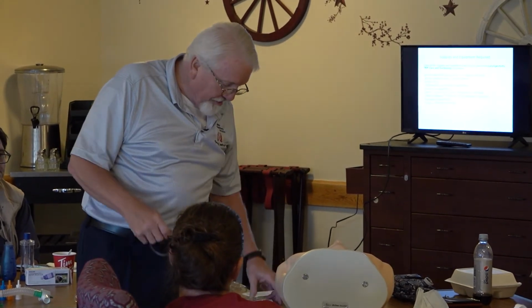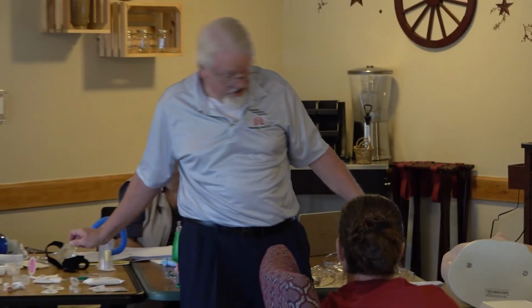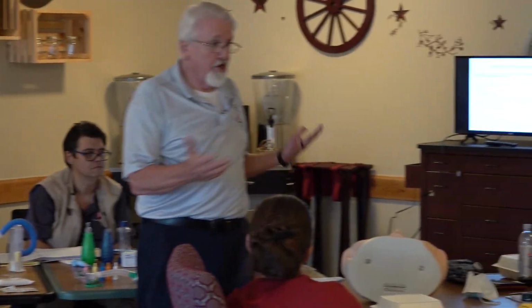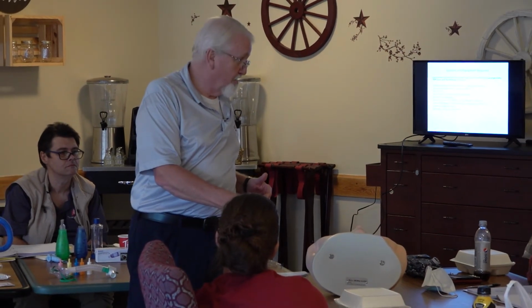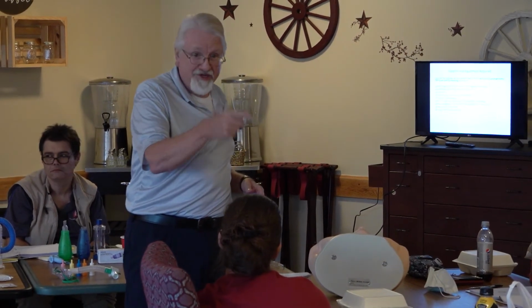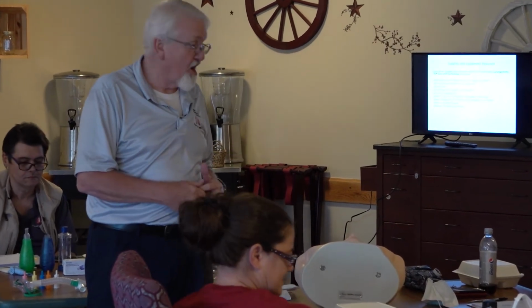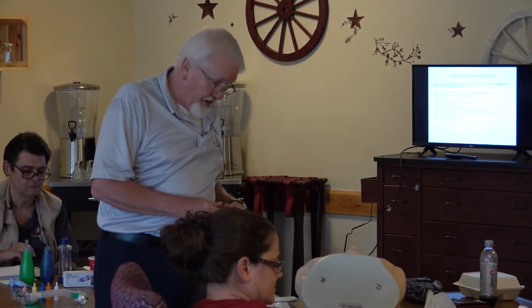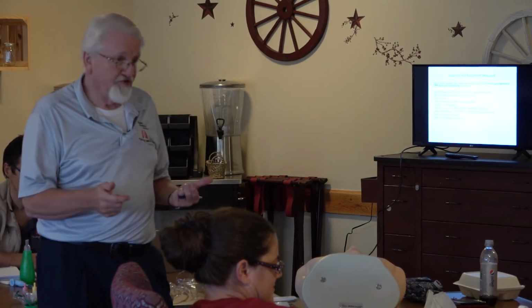Usually these are closer together in the bed. I'm not walking halfway across the room. But anyway, I've opened my pack and the catheter is still in there. I opened up my sterile gloves. I've already placed my pulse ox and everything on him. I've pre-oxygenated for about 3 minutes. He's up to 99. That's max for Bob.